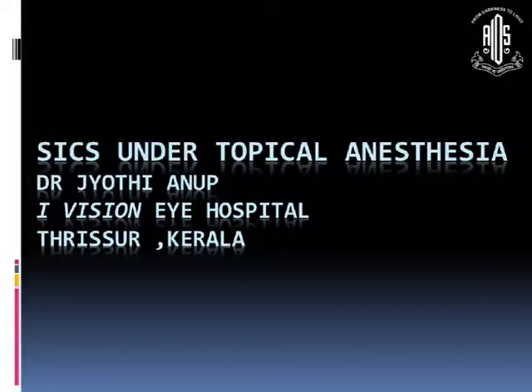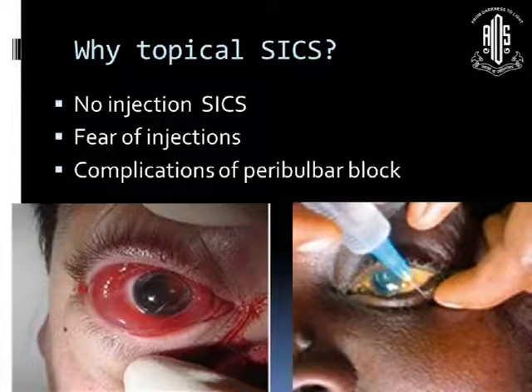My topic for today is topical anesthesia. The technique which I will be showing here is not exactly a topical SICS. It can be called a no injection SICS. From the patient perspective, no injection is being given to the eye.